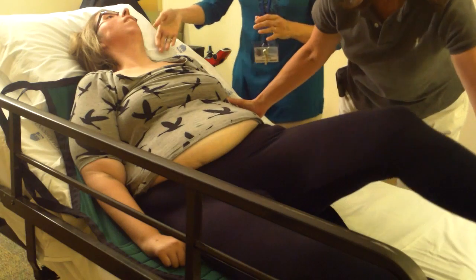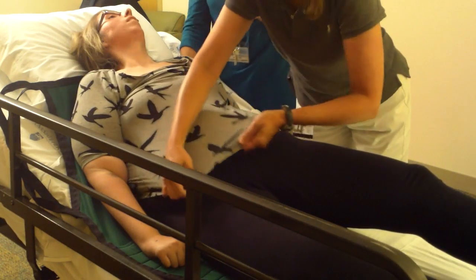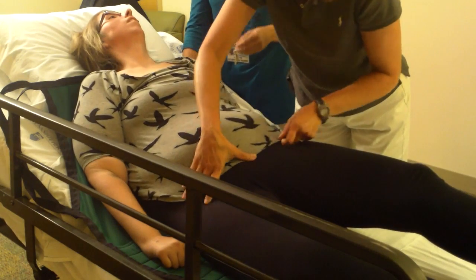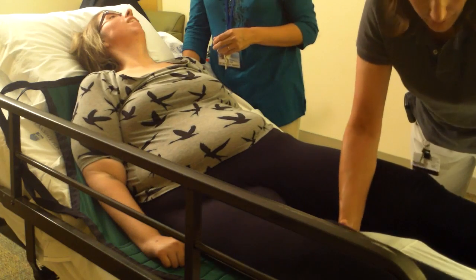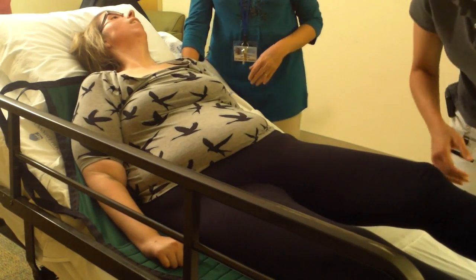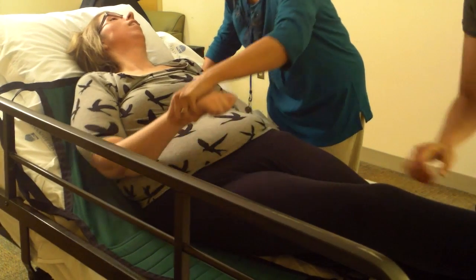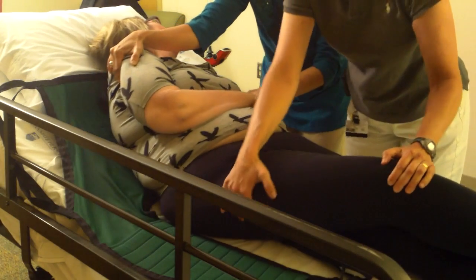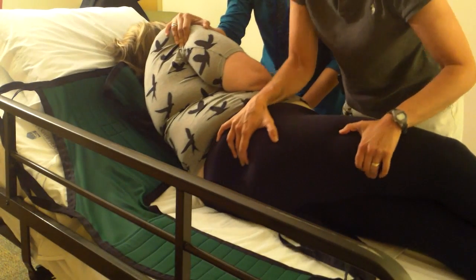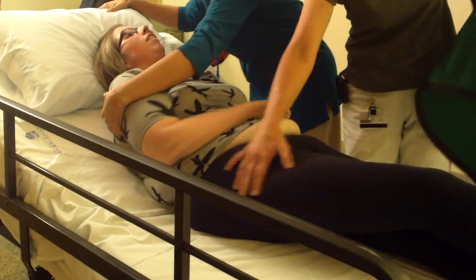You will then roll the patient back, reposition, bend the right leg over the left, position her arm and roll to the left to be able to take the pad out.